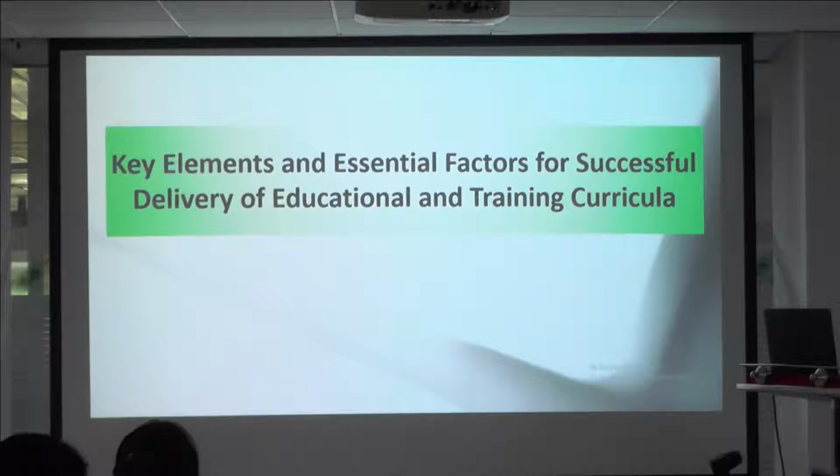So what we'll do in the coming half an hour, we'll give you an opportunity to use the CAT for suturing. We'll show once more the video, how it is done, actually very good. We distribute first the forms, so please look at these forms.